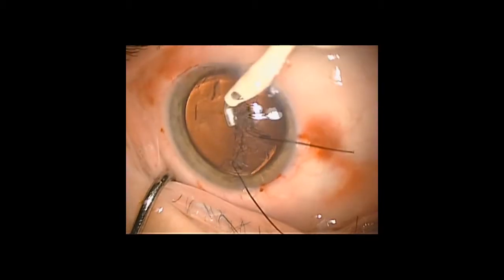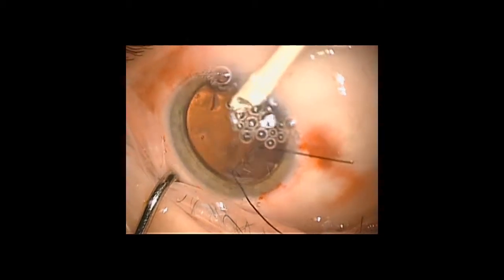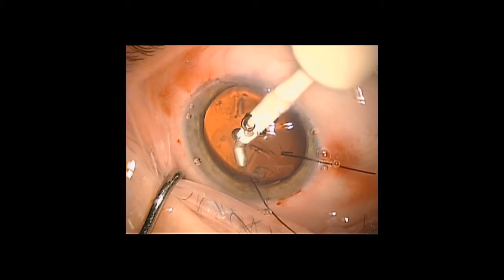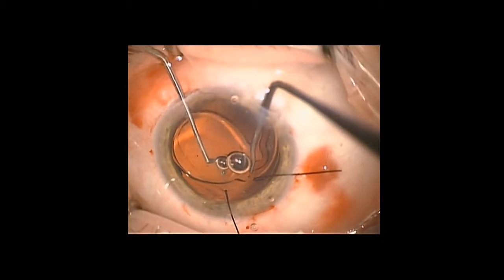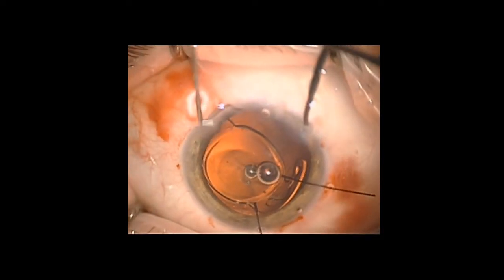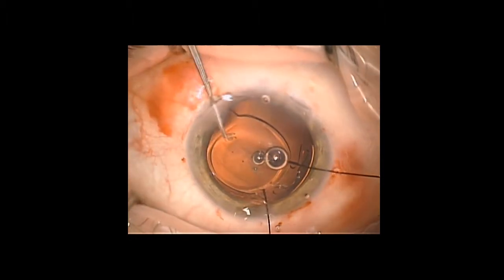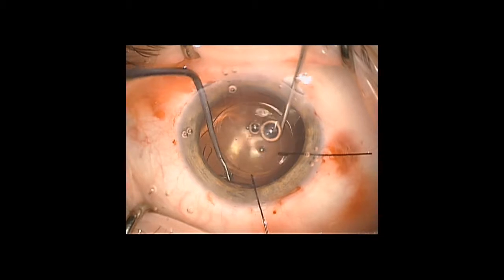The rest of the cortex is now gently removed with the supporting capsular tension ring providing sufficient countertraction to allow cortex removal. To introduce the trailing haptic into the capsular bag, principally a downward force is utilized to enable the haptic to enter without introducing further potentially damaging rotational forces.